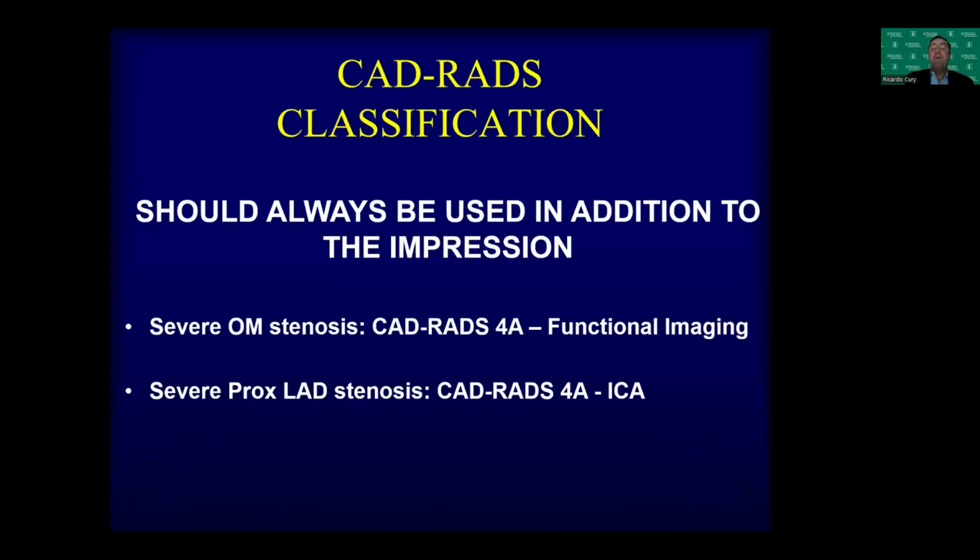Very important, we always get this question, and once people start implementing in practice: a proximal LAD lesion is similar to an OM lesion, and both will be CAD-RADS 4A.